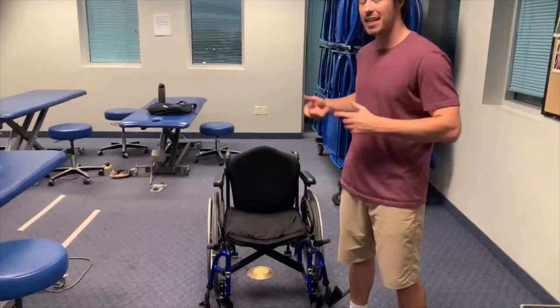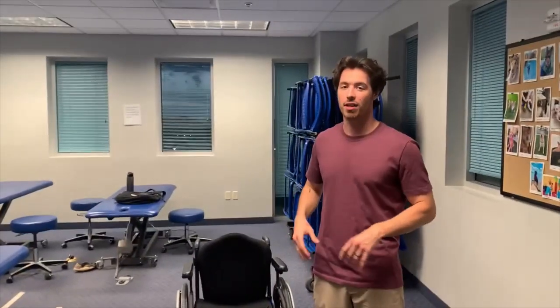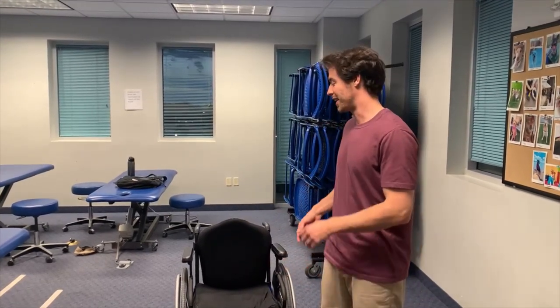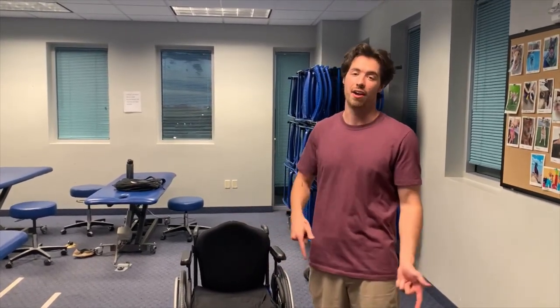Hi, I'm Reid. I'm a student physical therapist here at Midwestern and we're going to talk about a T10 and below paralyzed patient that has bilateral lower extremity paralysis and how to get into a wheelchair once you've fallen out of it. So we'll go ahead and go through all that.